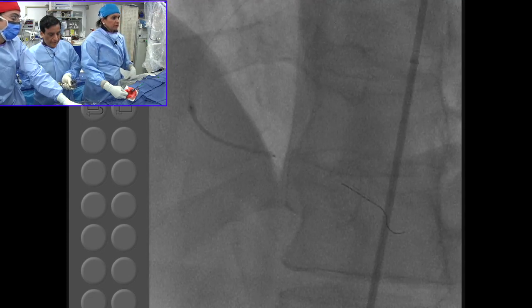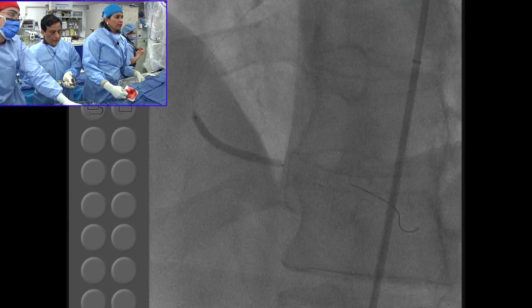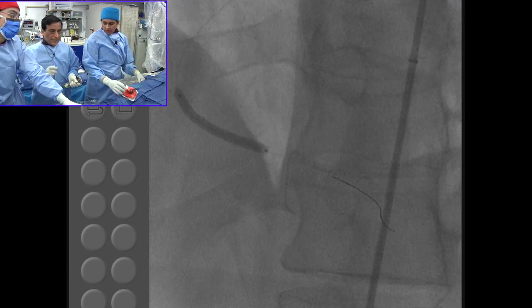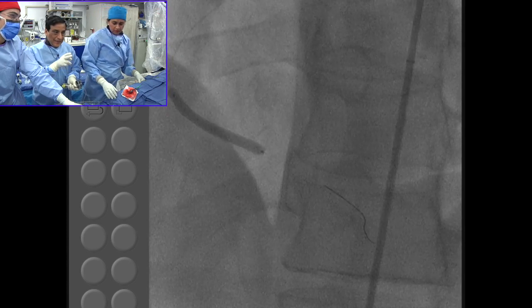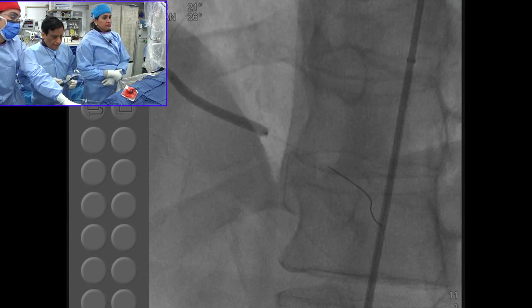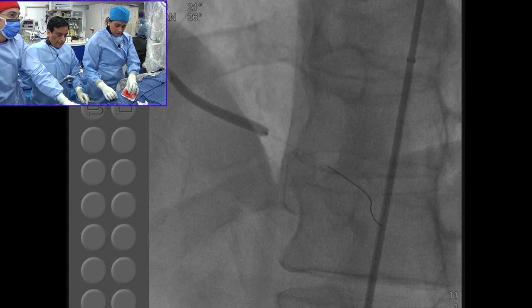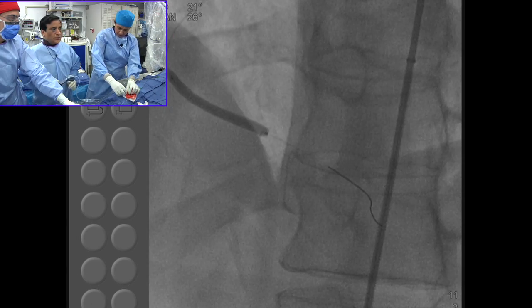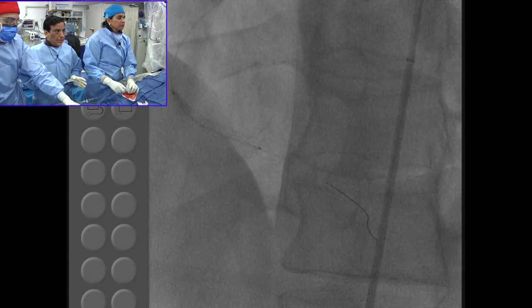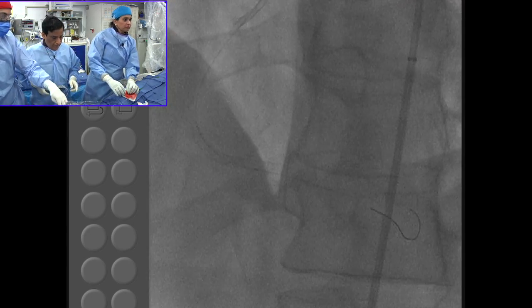I think so far, I don't think we should change it. The reason is that we still have to overcome this issue of 12, 14 atmosphere, the issue of higher scaffold thrombosis in the randomized trial. Therefore, till we answer that question, I don't think we should. Actually, one of the cases which happened in the GHOST EU, the patient stopped antiplatelet therapy after 9 months or so. So clearly, I think we still need to continue as planned.